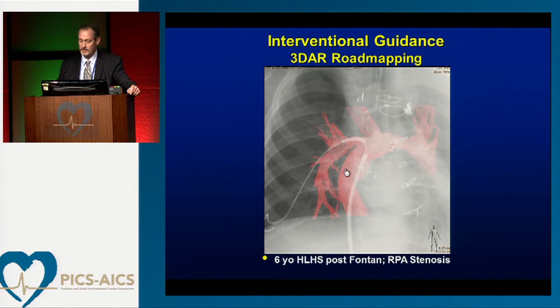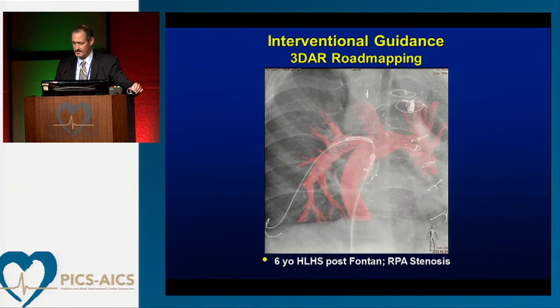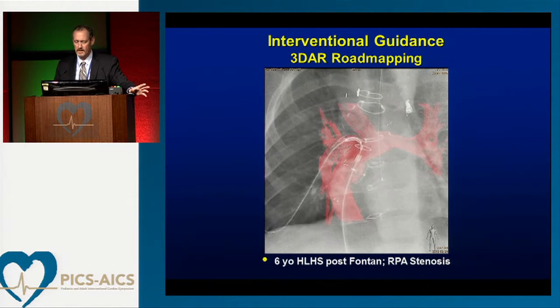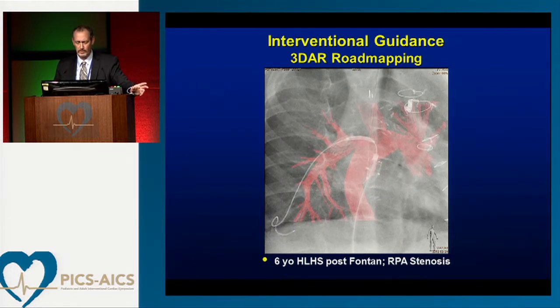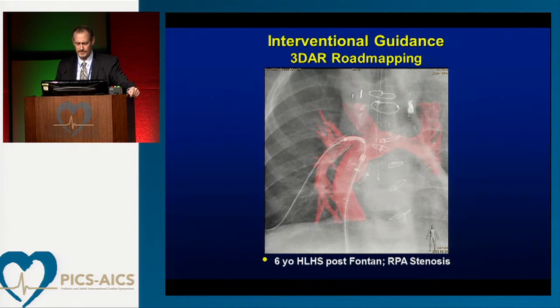And here you can see the confirmation angiogram, running a little bit slow, but it actually has the anatomy pretty well down as far as the registration. So again, showing one of the advantages of the system is that to really check the position of the stent and make sure it's not going to interfere at all with the Glenn anastomosis, instead of shooting more contrast and using angiography, just under fluoro using a roll, we use a three-dimensional image to help us with this endeavor. So hopefully, over time, saving contrast, saving radiation.